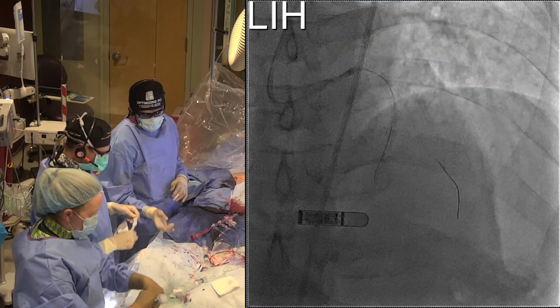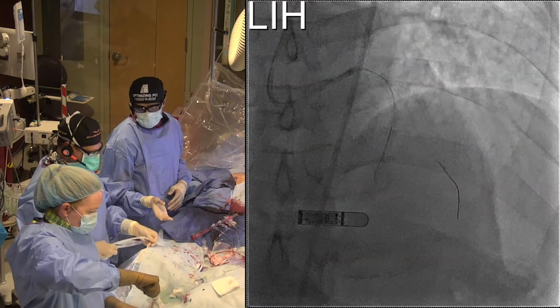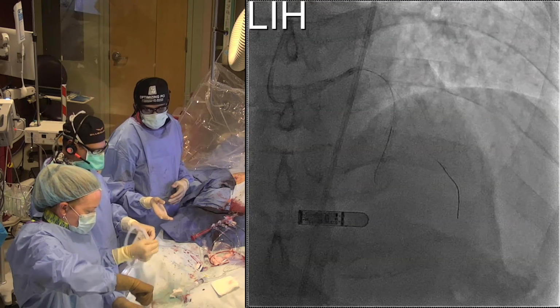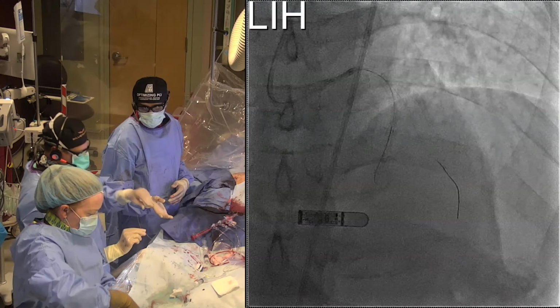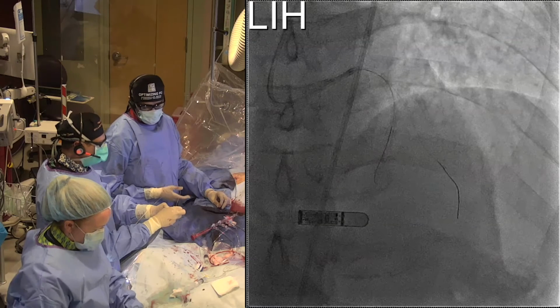So sure, let me ask you a question. Can you do angio-guided PCI if you always check the post-PCI physiology, and then leave your imaging for bailout? You probably could. You know, I mean, it's not gonna be the only concern I have.